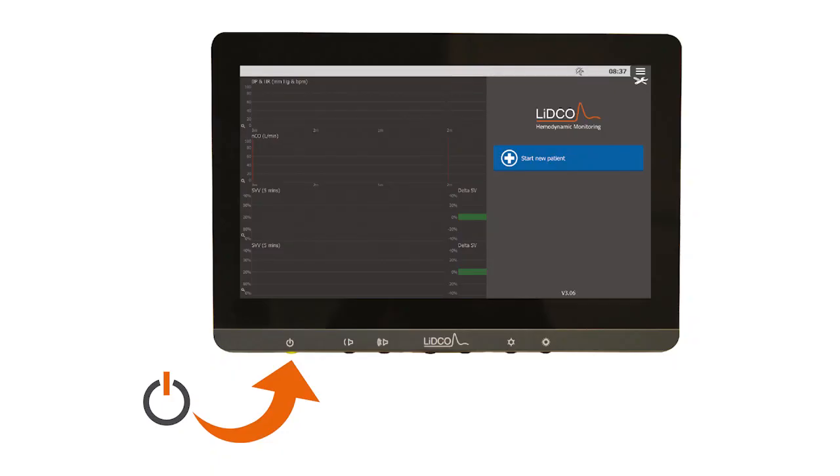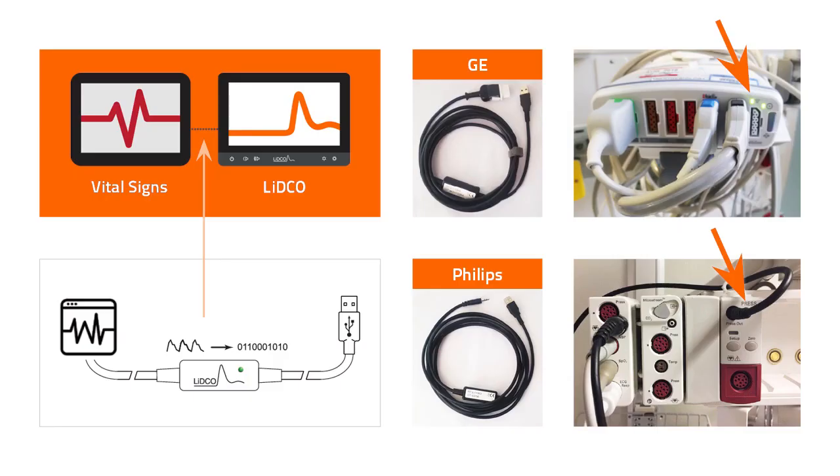First, power on the LIDCO monitor by pressing the button underneath. Next, share the arterial waveform through a single cable connection. The USB plugs into the LIDCO and the other end connects to the vital signs monitor. Here are examples for GE and Philips.